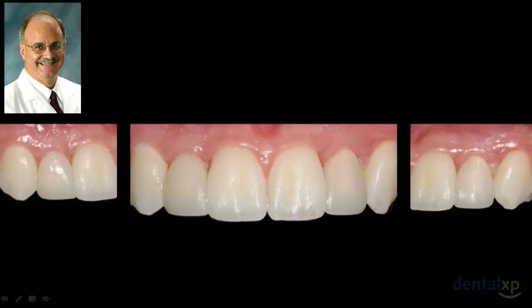Now, if I showed you this image and said, hey, what do you think? Maybe not such a bad result. Well, those papillae don't look so great on either side of the lateral, both sides, right and left. I think you would agree. However, if I told you this was about 4 or 5 weeks post-prosthetic completion, then you'd say, okay, well, maybe, Mike, you're onto something here.